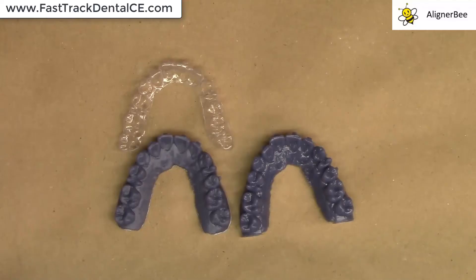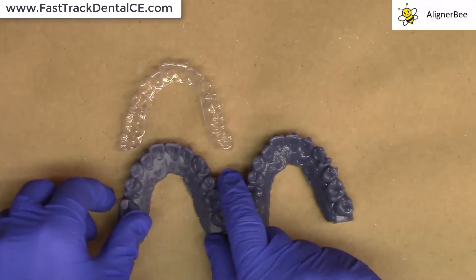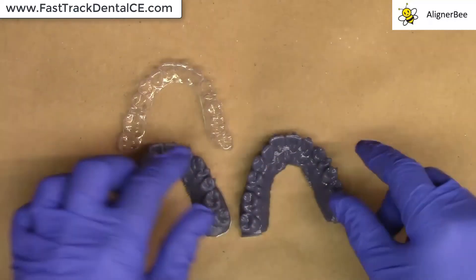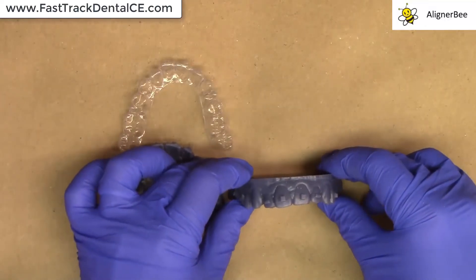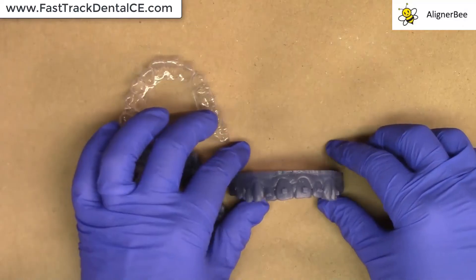ULAB has had a big update to the software, allowing us to now print either horizontally or vertically in print orientation on the 3DBuild platform. The model on the left is in the horizontal orientation, as I had printed all of his previous models, and the model on the right was printed in the new vertical orientation to help maximize the area on the build platform.